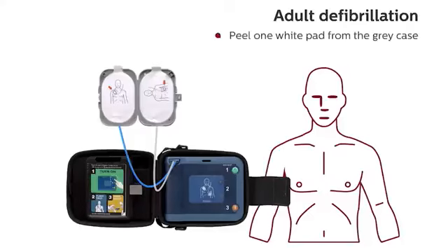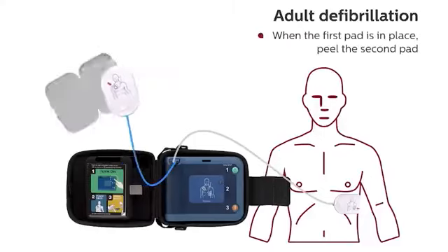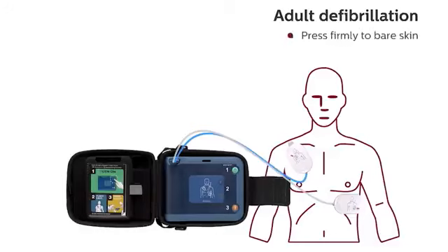Peel one white pad from the gray case. Place pad exactly as shown and press firmly to bare skin. When the first pad is in place, peel the second pad. Place pad exactly as shown and press firmly to bare skin.